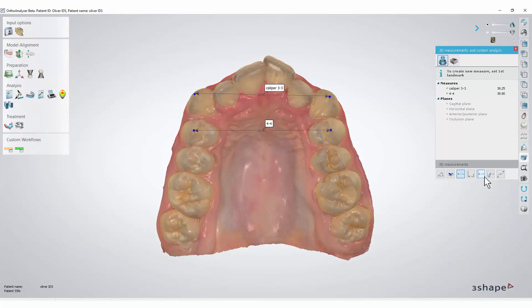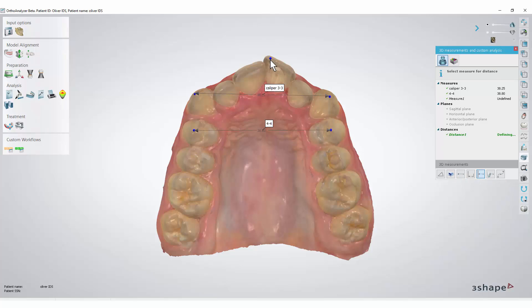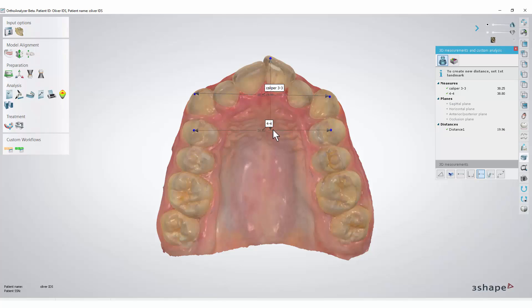Another measurement we can perform is distance to a line. We simply put a point on the tooth and select a line. This kind of measurement is by default named distance.